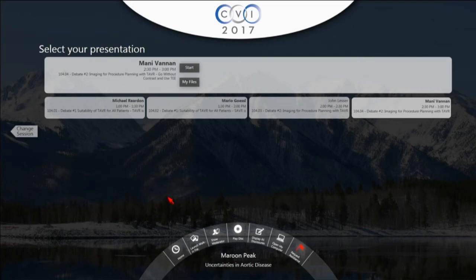No, I beg to differ, because that's if you're using X-plane on 2D. But we're not using X-plane in 2D. I think that's the point he's trying to make. So we're not doing 2D. 3D imaging on QLab is 3D. I understand the 2D part, but even on 3D on QLab, you have to create a plane to measure the annulus.